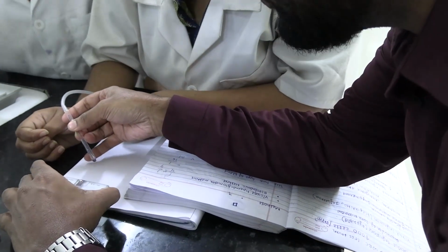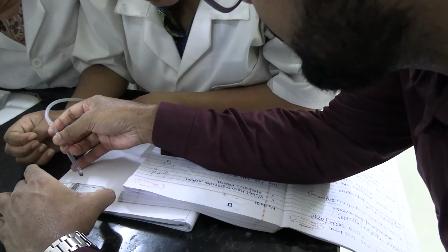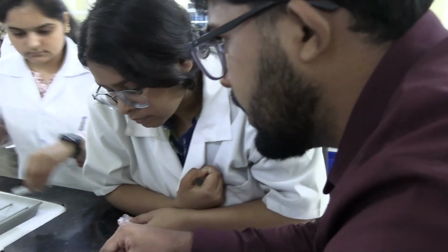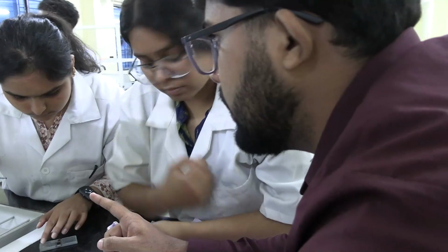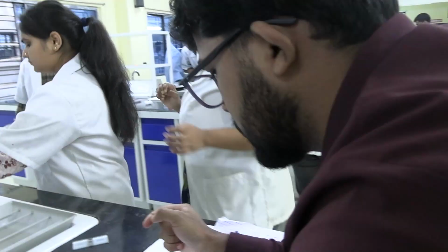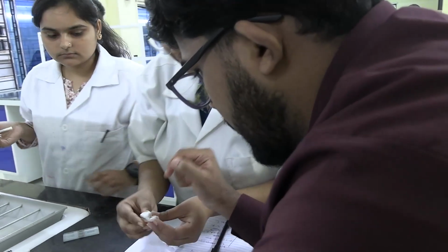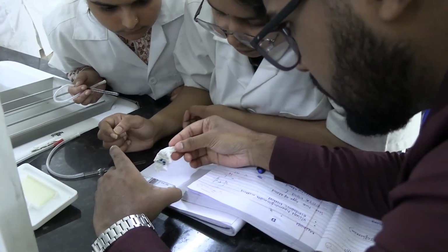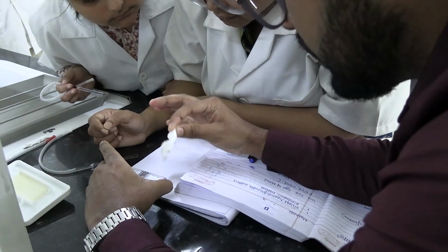How do you do it? You have to touch it at the edge of the cover slip, not the edge of the pipette. Okay? You can use it, it has charged. There is a little extra fluid here, isn't it? Give me some tissue paper. How will you soak the extra fluid? You have charged it. Let it settle.